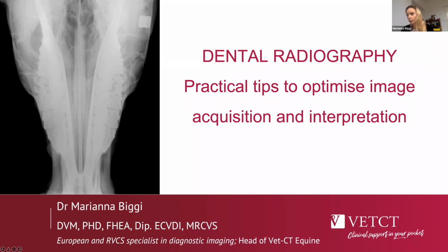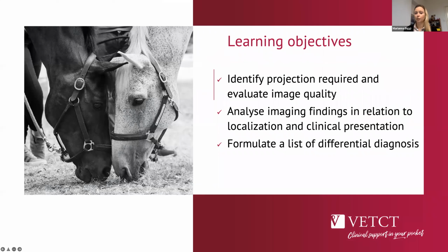So talking about dental radiography today, we're going to go through acquisition of imaging and image quality, and then we're going to evaluate some imaging findings and differential diagnoses for those.